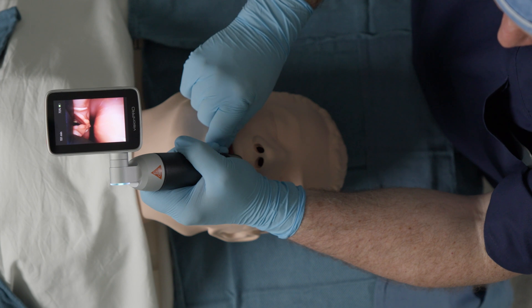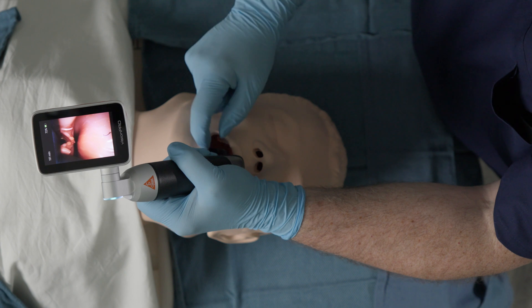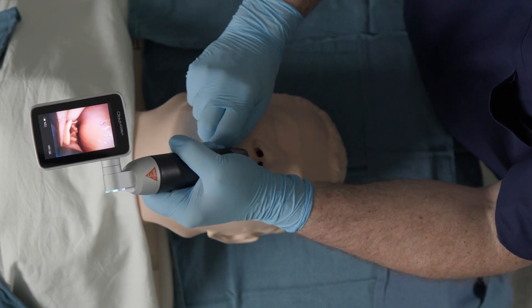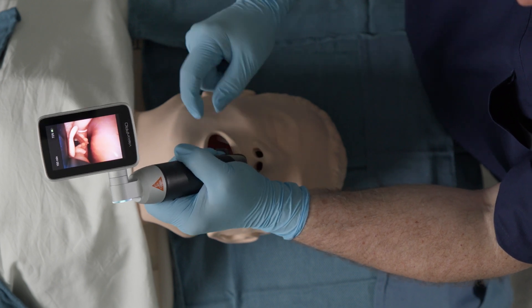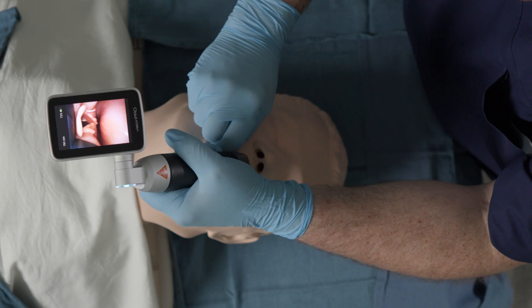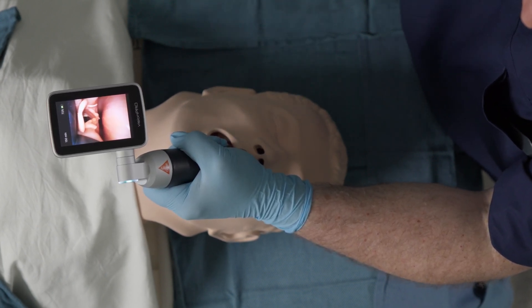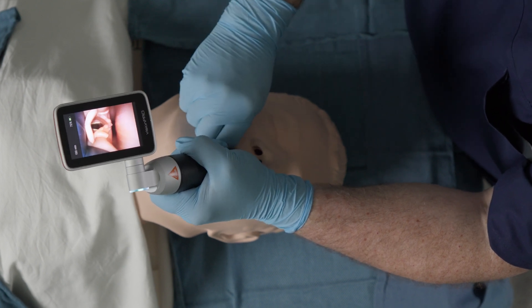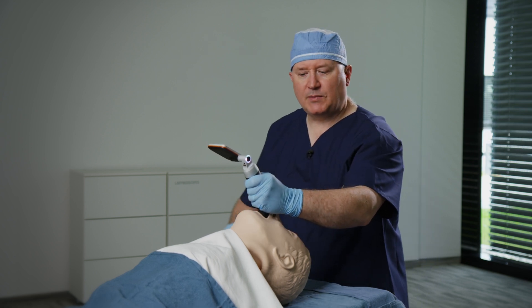I'll reduce my lifting pressure, but perform the maneuvering of the laryngoscope itself with the free hand to move it millimeter by millimeter. Now that I can see the tip of the epiglottis, I can use my free hand with this little pinching maneuver to push it into the vallecula while modulating the lifting pressure so that I am appropriately sliding over the base of tongue and into the vallecula. I'm going to go ahead and give myself a nice grade one view on video laryngoscopy and on direct laryngoscopy.